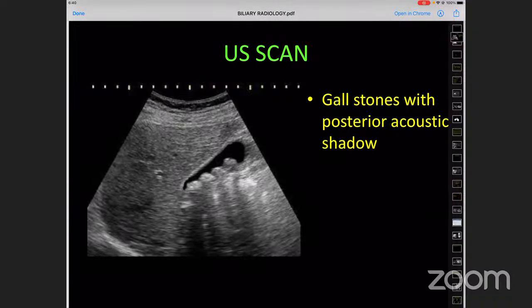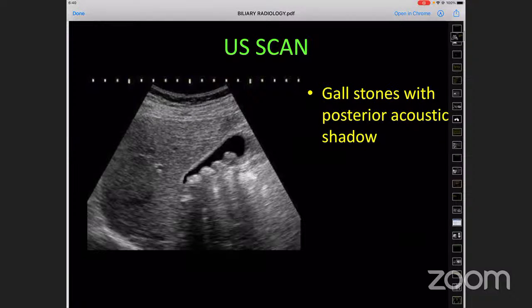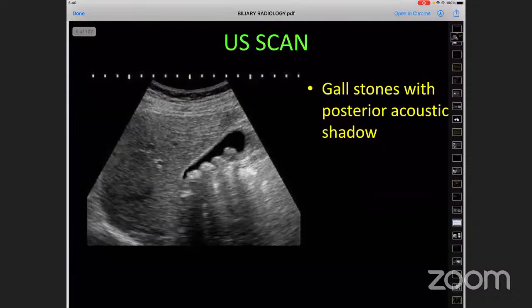With this picture in concern, I would like to start by asking Dr. Bakshi, because as I've said, we are both surgeons. I'm a professor in general surgery, and Dr. Bakshi is a surgical gastroenterologist. Dr. Bakshi, to start with, in your evaluation of a patient with symptomatic gallstones, what are the exact points that you want your radiologist to comment upon when you order an ultrasound scan? Well, that's an important question.